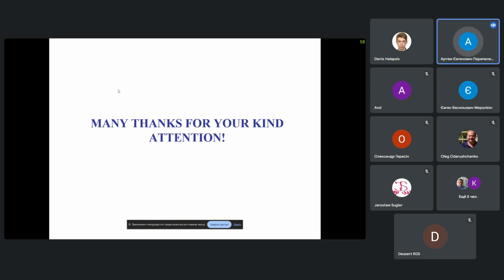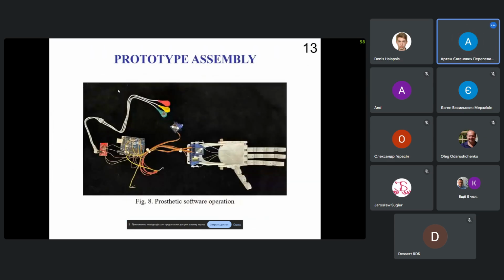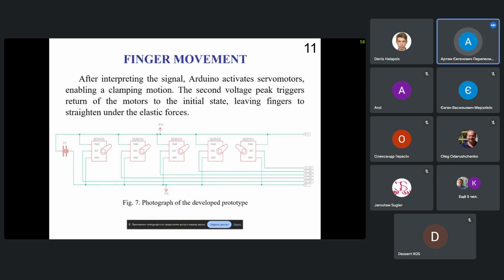Slide 11 and figure 7, and the question is the following. It's really interesting. I hope that you will improve the current implementation with 3D printing of the prototype, improvement of the servo motor, and replacement of the PCB of Arduino by a dedicated microcontroller, or maybe the same but with a wide connection to avoid the problems in the connections and connectors. But this is a fantastic prototype.